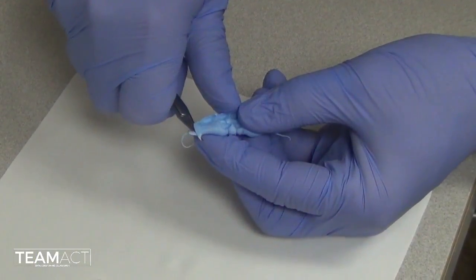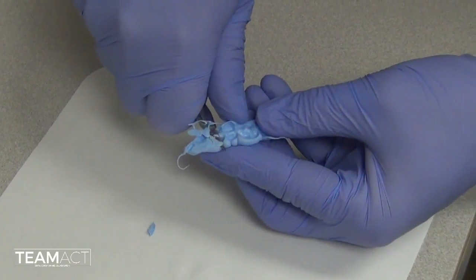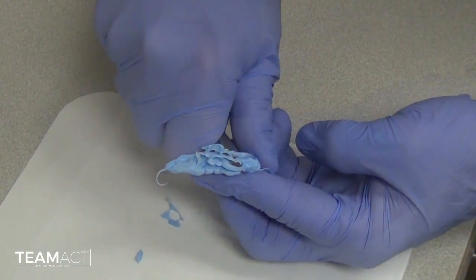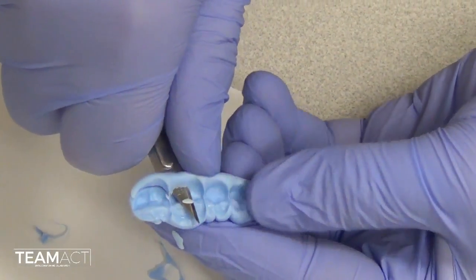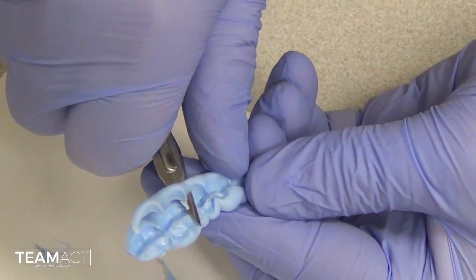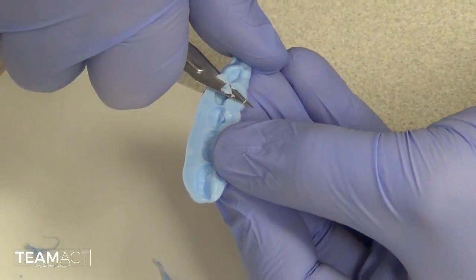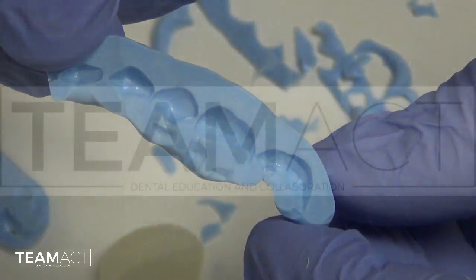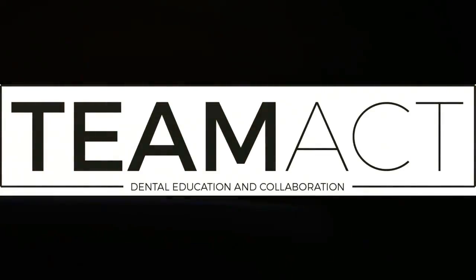When you trim the records, be very careful not to injure yourself. You will want to remove any occlusal groove anatomy as well as any interproximal anatomy. All you would like in the end is the cusp tips to be present to ensure that they best seat onto the models obtained from the impressions you made previously.